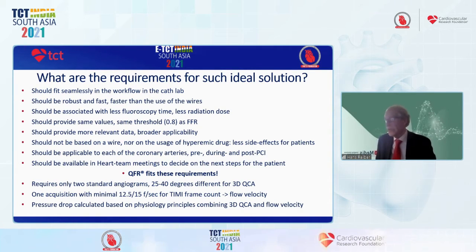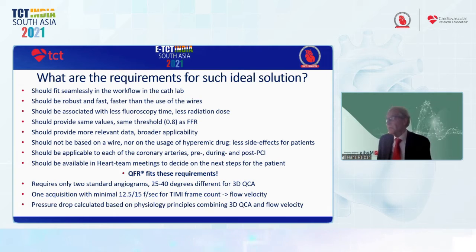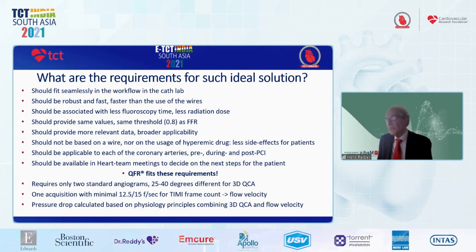We will also hear further about the value of the post-PCI QFR, what quality, and how we can use that to assess the quality of the PCI. Of course, it should be available in heart team meetings to decide on the next steps for the patient. And with that, we believe, and I hope to convince you of that, that QFR fits these requirements.